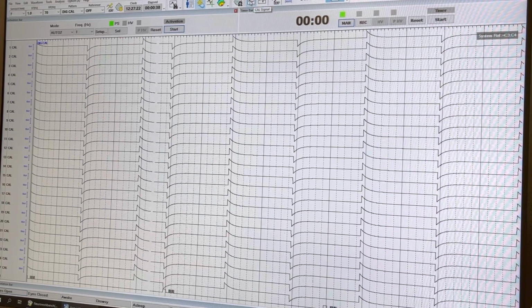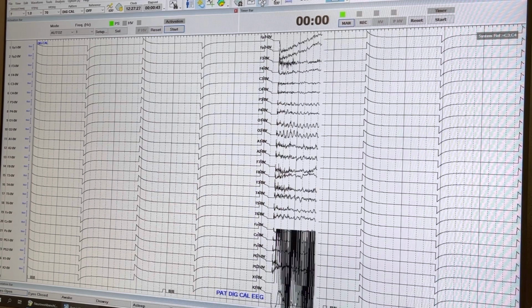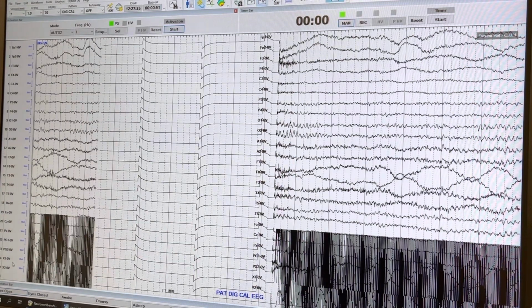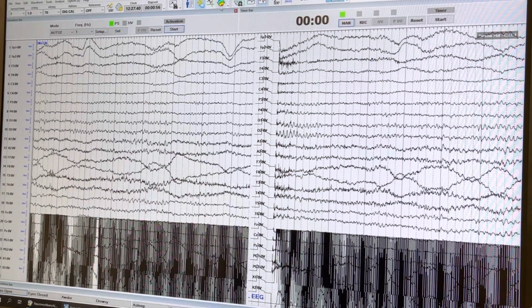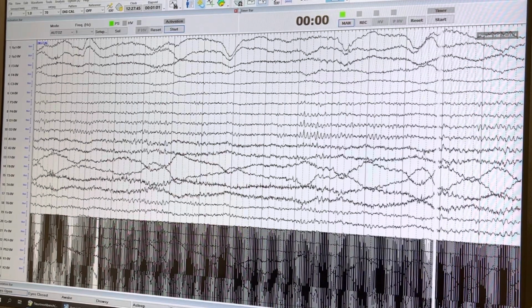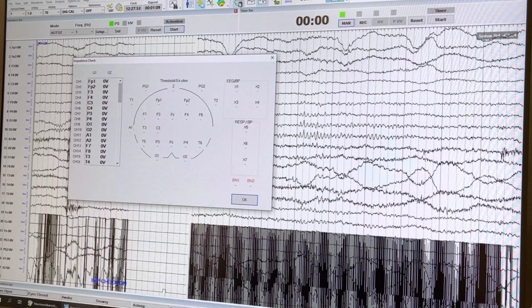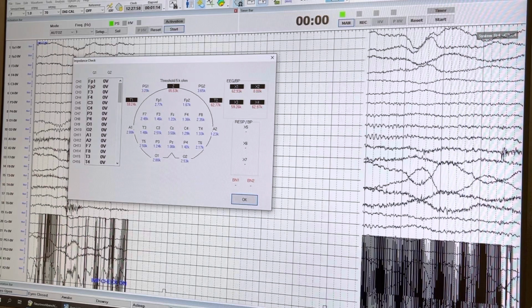Here's the cal signal here. Well, we'll go to the EEG signal. And now the DigiCal comes up. Hold on here. This is going to be the same as BioCal. It's just called DigiCal. And so here's the impedance meter. So let's put that on. You have to hold it down for about 3 seconds. Okay. And so one of the electrodes is really high.